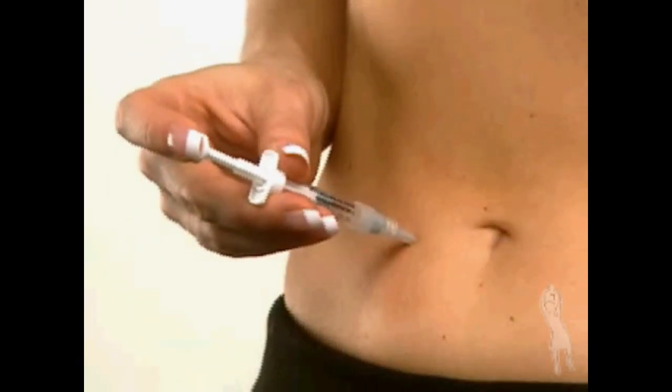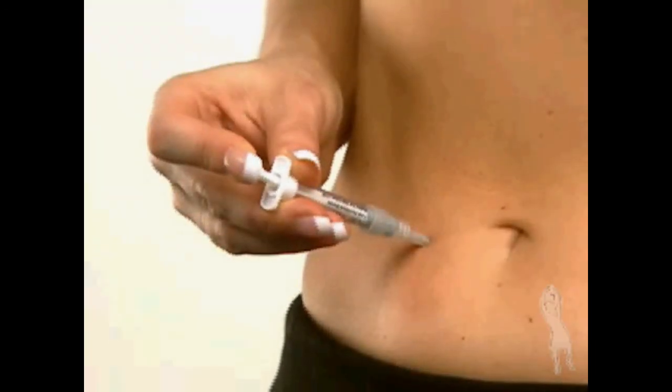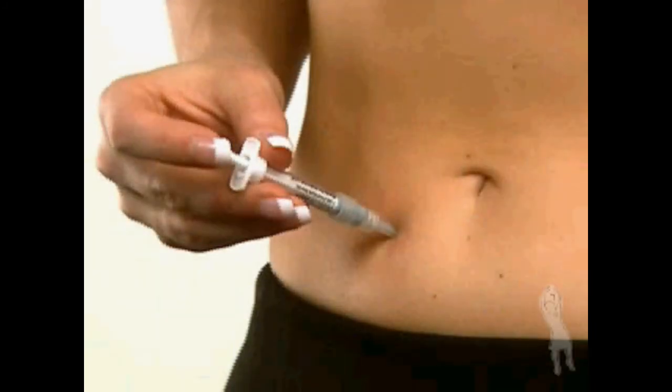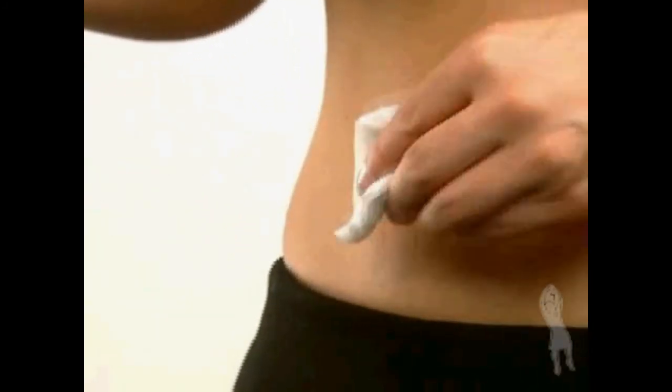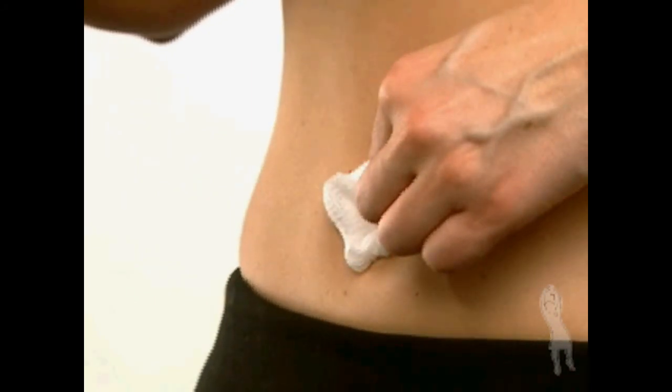Release the hand pinching the skin and depress the plunger in a slow, steady motion until all the medication is injected. Gently withdraw the needle and apply pressure to the injection site using a gauze pad. Discard the empty syringe in your safety container.